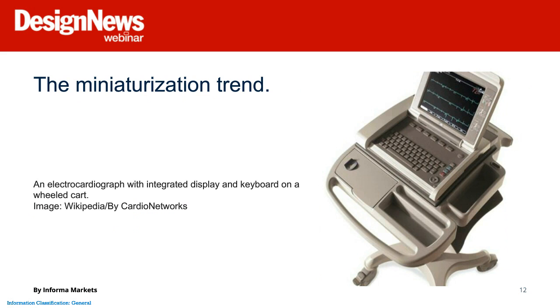So now we've taken a little glimpse of the past, so let's move up to current day technology. Most of us recognize this. It's an electrocardiograph that millions of hospitals and doctors' offices use. It provides a graph of the heart's electrical activity. Again, it's voltage versus time, but this one does so without the buckets of saline solution that we saw a few slides earlier. And this is a time-tested technology, and it's considered the gold standard of electrocardiographs.